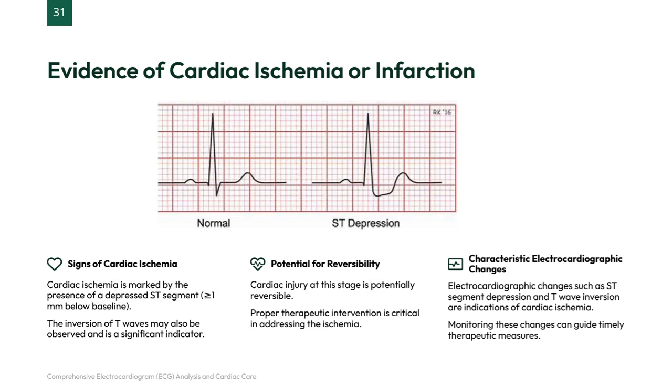By carefully monitoring these characteristic changes on the ECG, specifically the ST segment depression and T wave inversion, healthcare providers can intervene quickly to help prevent further damage to the heart.